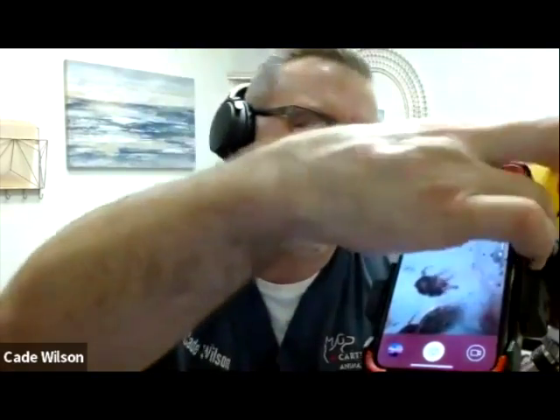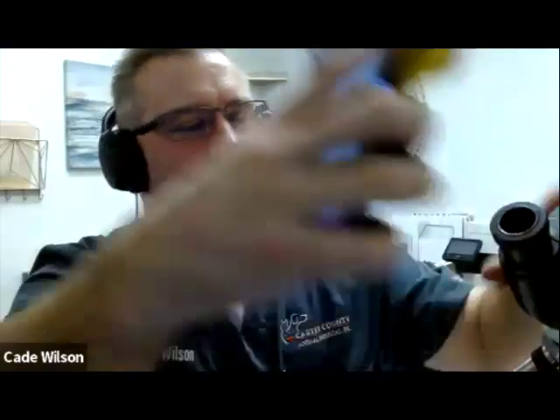When we send those out, if you know you have a 30 millimeter microscope, you just say we want a 30 millimeter, and that's what we send you. We've also realized over the last year that not everybody knows what type of microscope you have. So whenever somebody sends us a 23, we have these little shims that go over it and also make it a 30. So anytime we send a 23, it comes with a 30 right now.